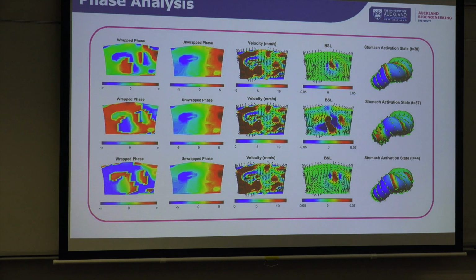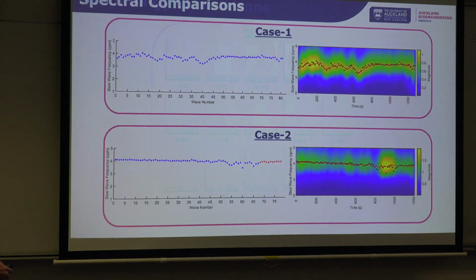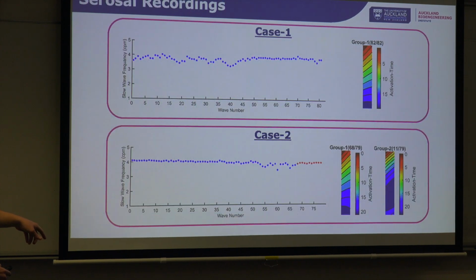In pig number 1, we said it was non-constant in time. Does that mean it had different velocity fields? Sorry, which slide? Yeah, the forward one. The actual slow wave was relatively stable over time, but the intervals between the slow waves were different. Does that make sense?